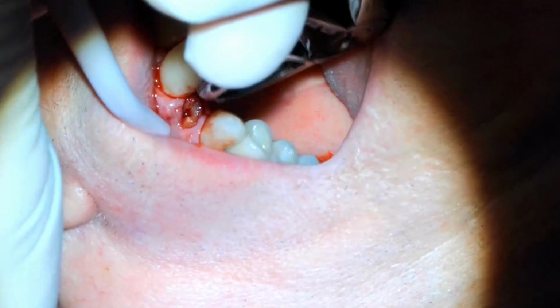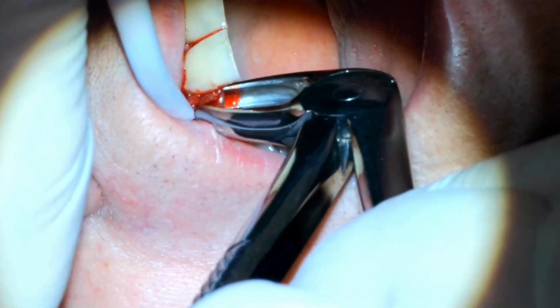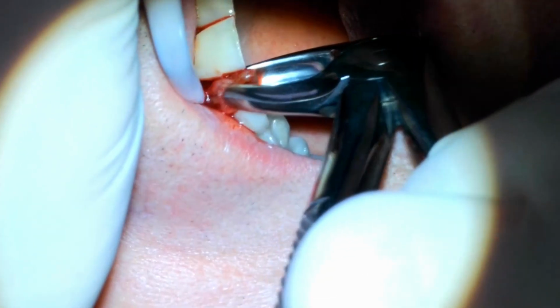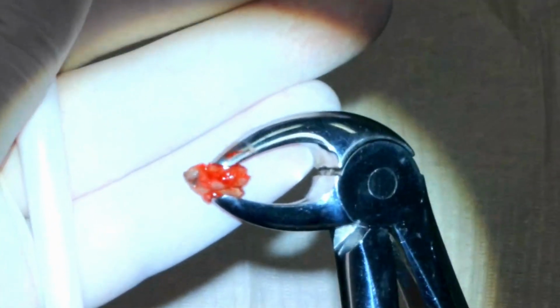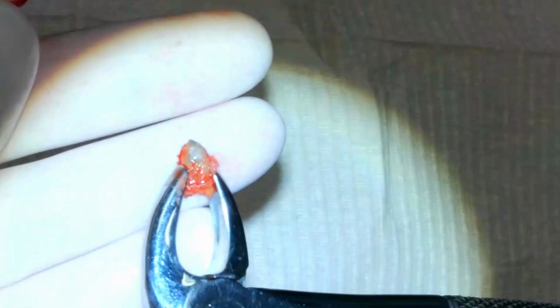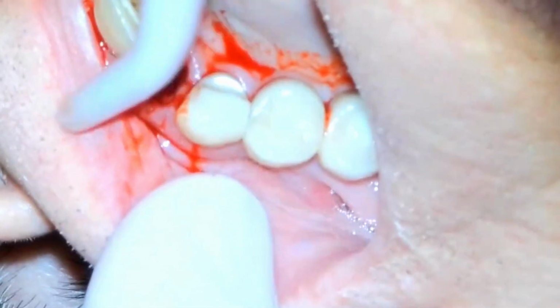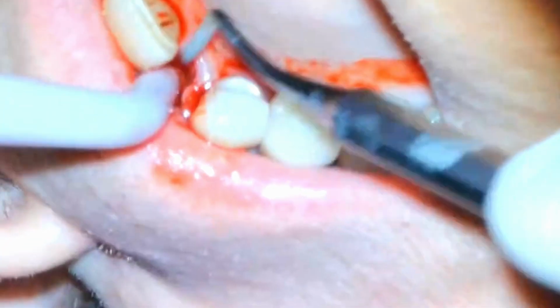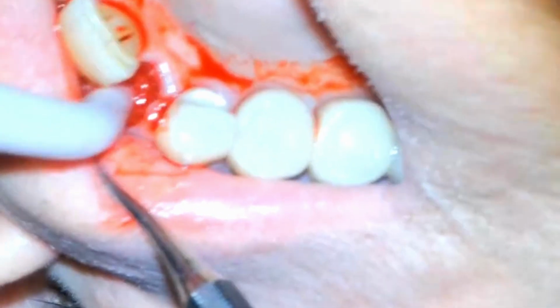So next I'm just going to grab my ash forceps again, just to grab the root tip and remove the whole thing. And there it is. As you can see, I'm just going to check and make sure we got the entire root tip. And it's pretty ugly and gnarly and messy. And now I'm going to go back, vacuum out the socket, and make sure there's no granulation tissue in there. I'm going to use my spoon excavator just to make sure it's nice and clean.